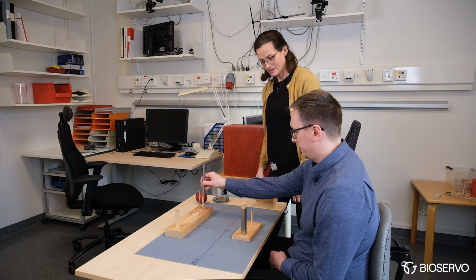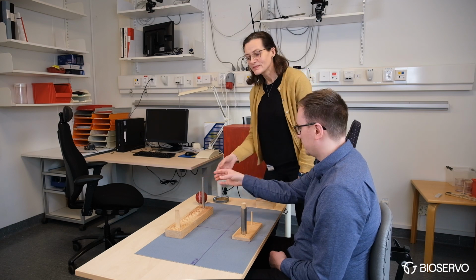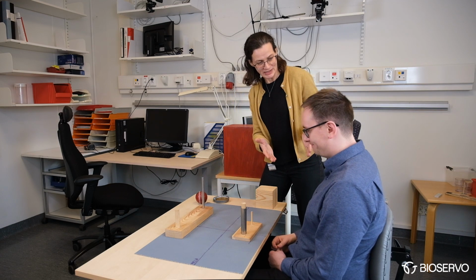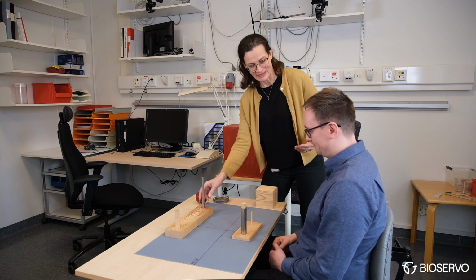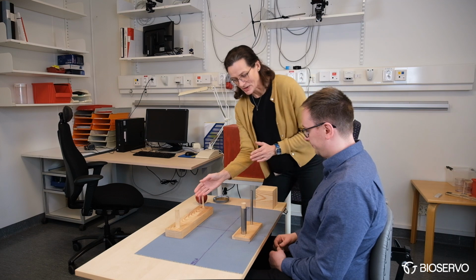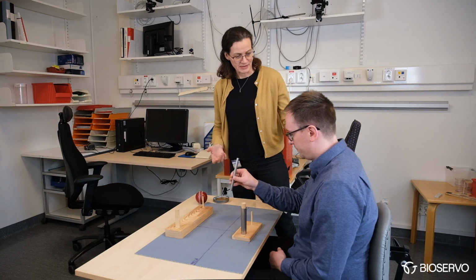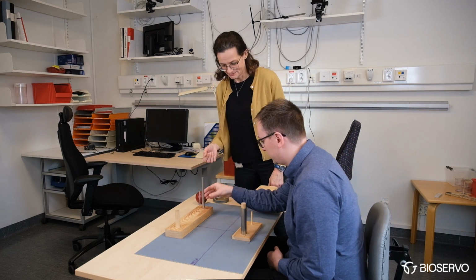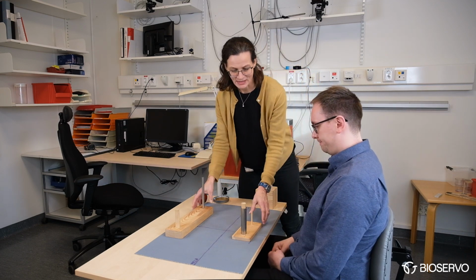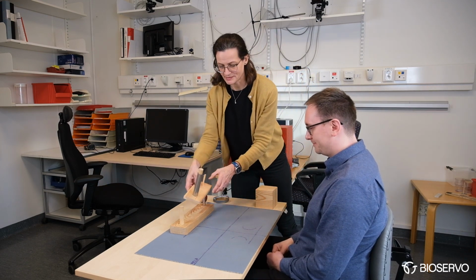And this is also to reach forward, I suppose. Exactly. And nicely, you didn't have to go forward with your trunk or your body. What happens with patients is that you take that and then you have to move forward. So we see also this compensatory movement here. Okay, this is also a compensatory movement. So these are some examples from that test.